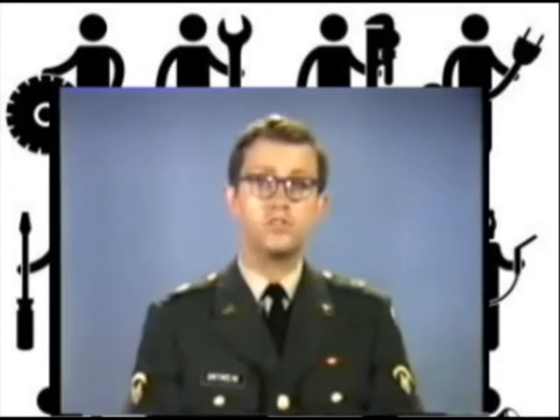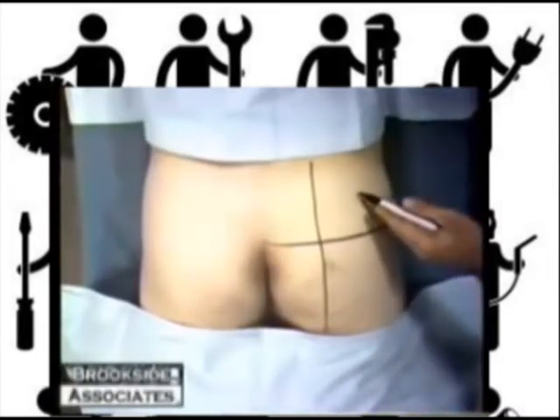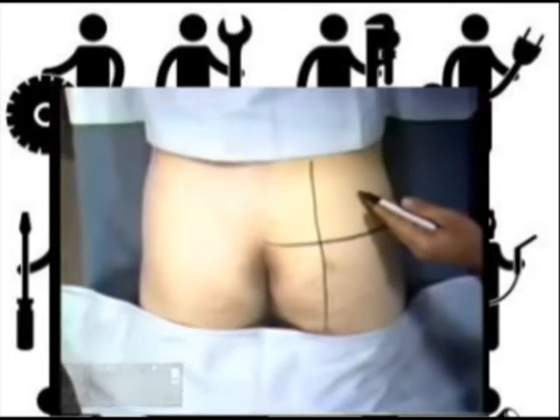Again, it is demonstrated on a patient. Draw a line from the sacrum outward and bisect this line, dividing the buttocks into quadrants. The site of injection is the center of the upper outer quadrant.